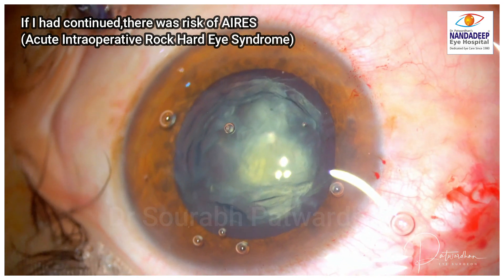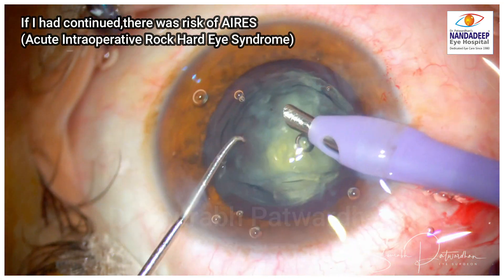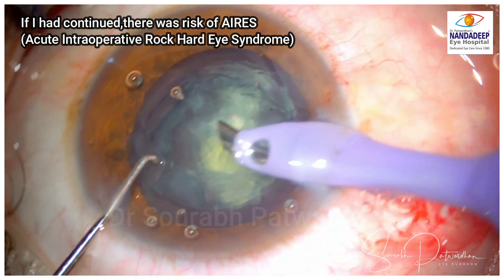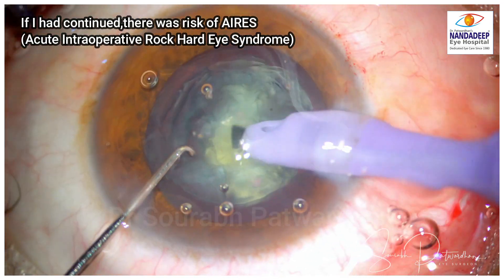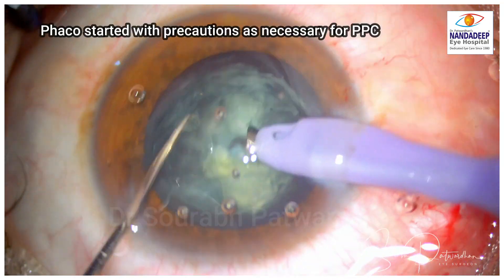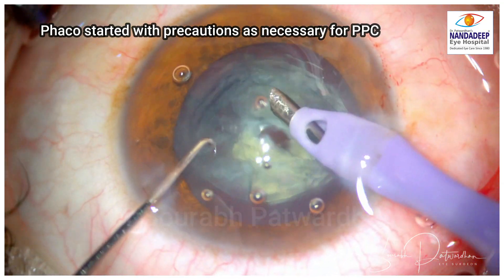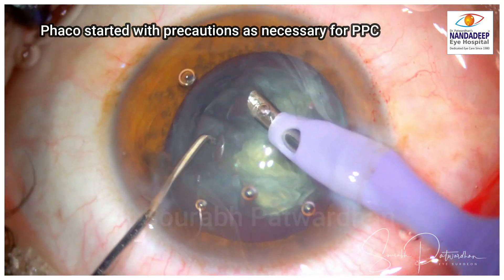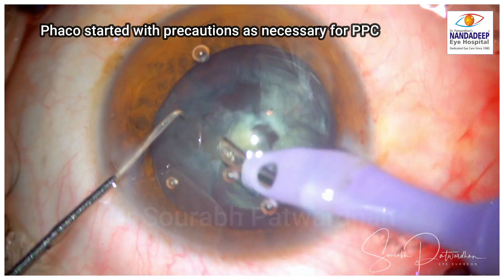If I had continued without doing the pars plana tap, there was a risk of acute intraoperative rock-hard eye syndrome, which would have made things even more difficult in the case of posterior polar cataract. So the necessary steps were taken to proceed safely.